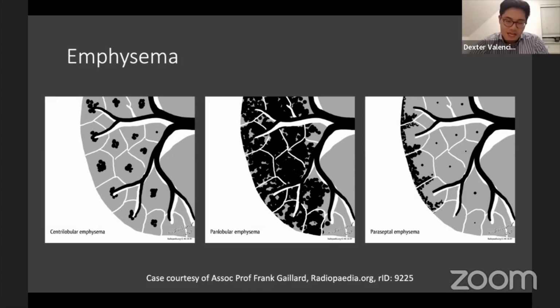I think if patients are aspirated and then, say, in 3 or 4 days or in the future they become more unwell and you think you're not really winning with your treatment, it's worth doing another chest X-ray because they could have gotten worse. The consolidation may have gotten a bit bigger. They might have a pleural effusion, stuff like that. So I think chest X-ray is good to start. I hope that answers your question.